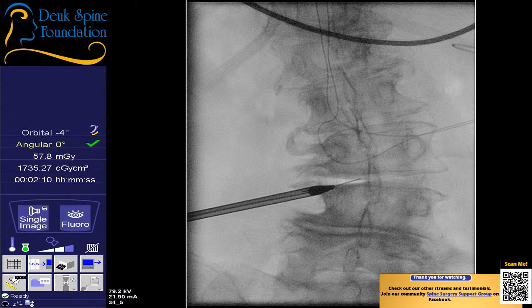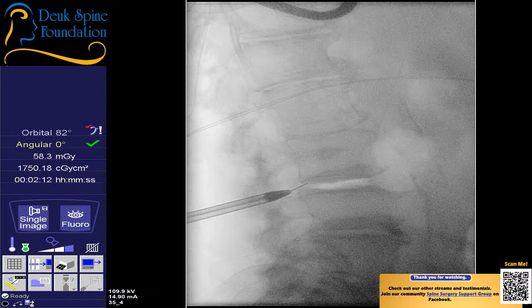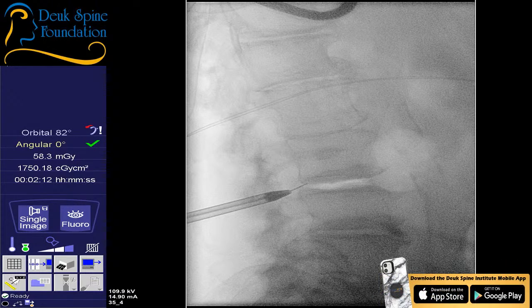So let's go back to a lateral. Once again, I'm on the fence on this level only because I feel confident we've already treated her 2 painful levels. This level certainly could be painful, but I'm also not getting access to it in the way that I feel most comfortable. So rather than risk having a complication, I want to probably assess how valuable it is to get in there and do this. But that's why I'm going slow and taking my time.